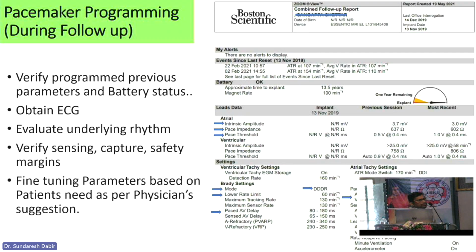During the follow-up parameters, maybe you can see the smaller values. We may not be able to see or read them, but definitely we'll show with the programmer so that we can understand.